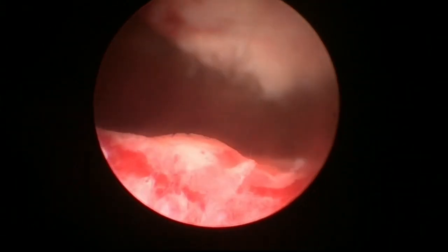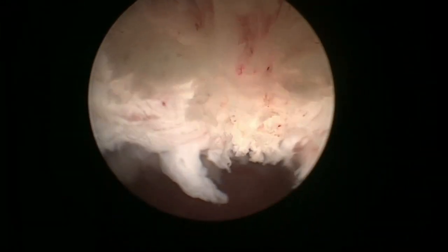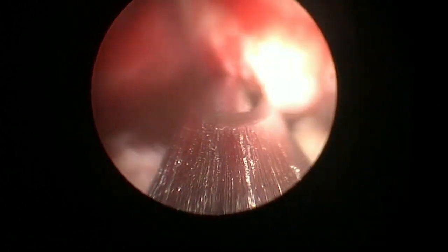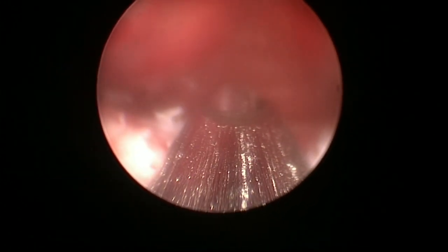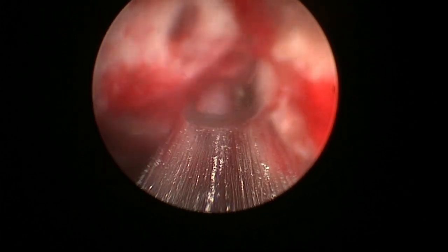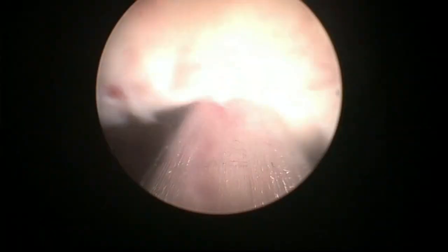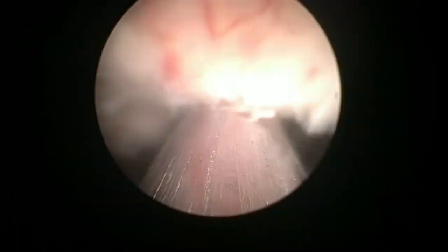There we are. We are inside again. This is the nephroscope that I use for morcellation. I'm going to put my blade near the bladder neck, but I'm going to bring it up so I am in a fixed position, trying to keep under the adenoma and morcellate. I want to push the adenoma a little bit, so push the blade a little bit inside.